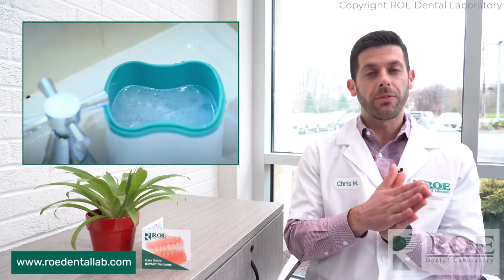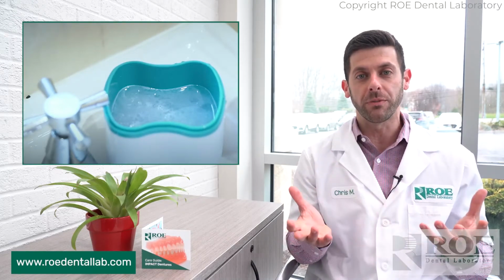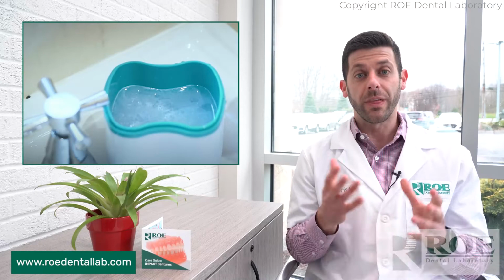And then if the patient is going to put it back in their mouth, of course, remind them to brush their gums before they put it back in. It kind of goes without saying.